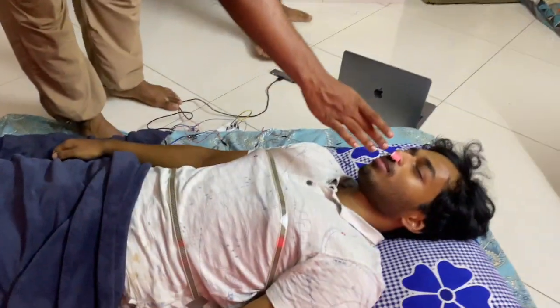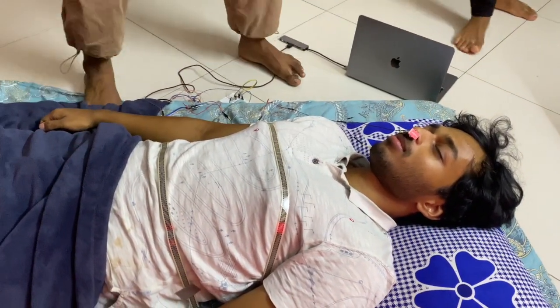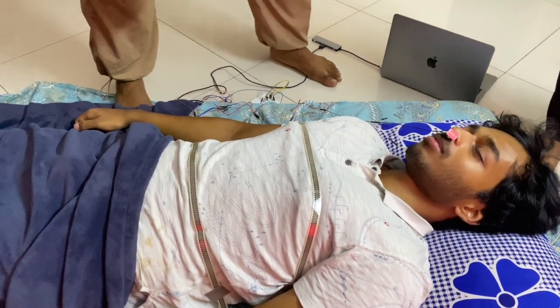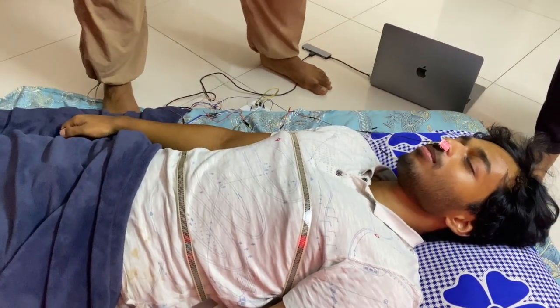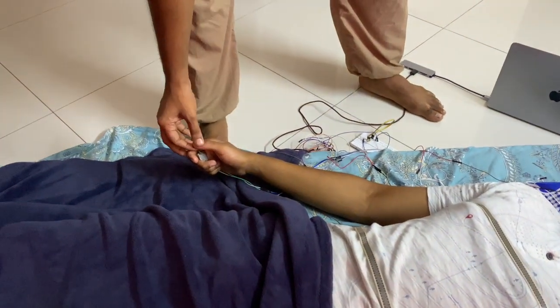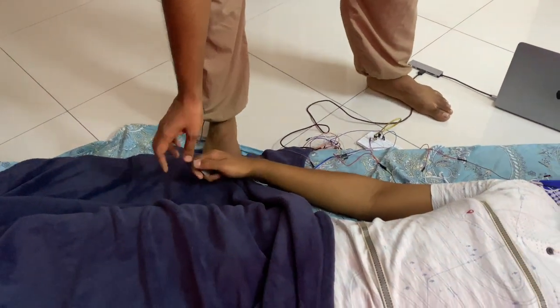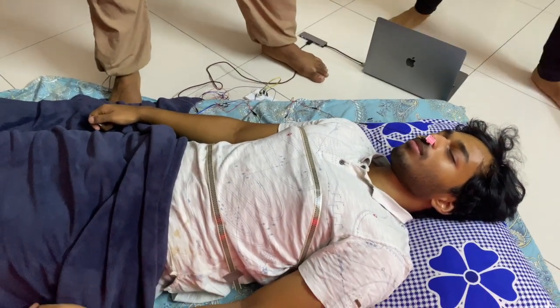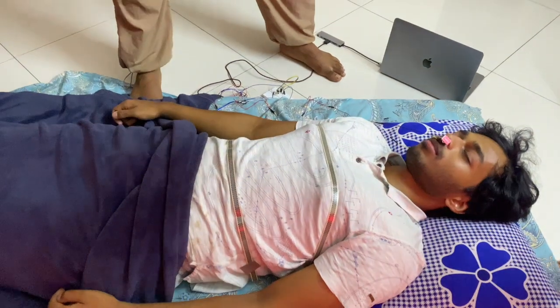And this sensor is used to measure the airflow while the user is breathing in and breathing out. And any drop in airflow will be recorded through the readings of the sensor. Then in addition, we have an SpO2 sensor which will read the oxygen saturation levels in his bloodstream. And depending on the airflow and blockages in his throat, this will also give us a signal.